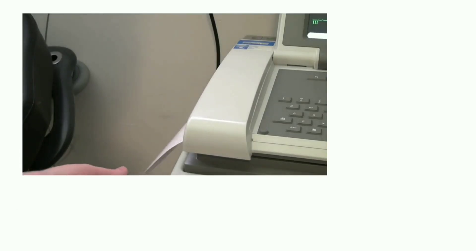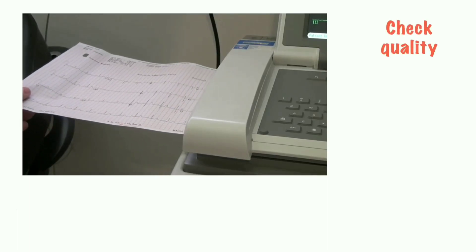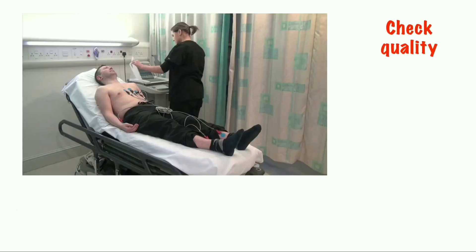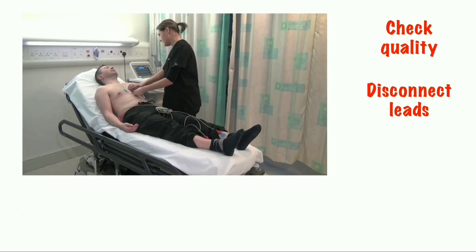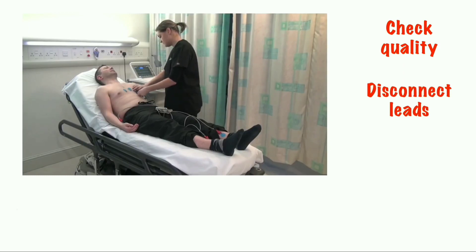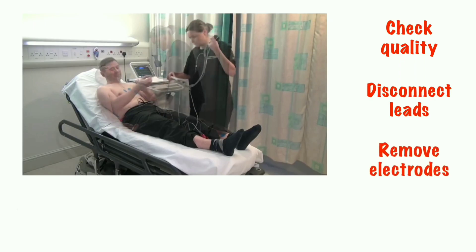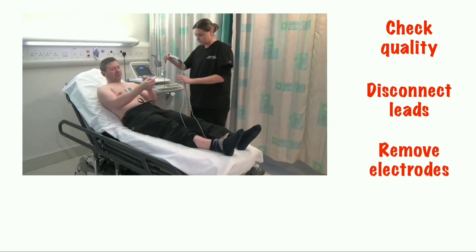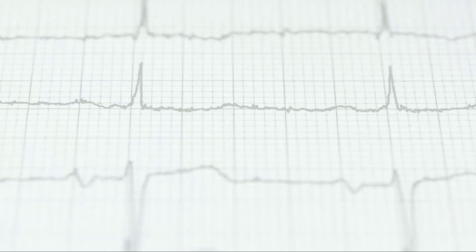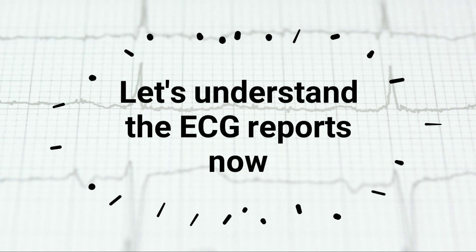And finally, you're good to go. Document your ECG, check the quality of the printout, and if you are happy, disconnect the leads. If not satisfied, repeat the recording until you are. Once done, remove all the electrodes and discard them. We have successfully completed the procedure to obtain an ECG.